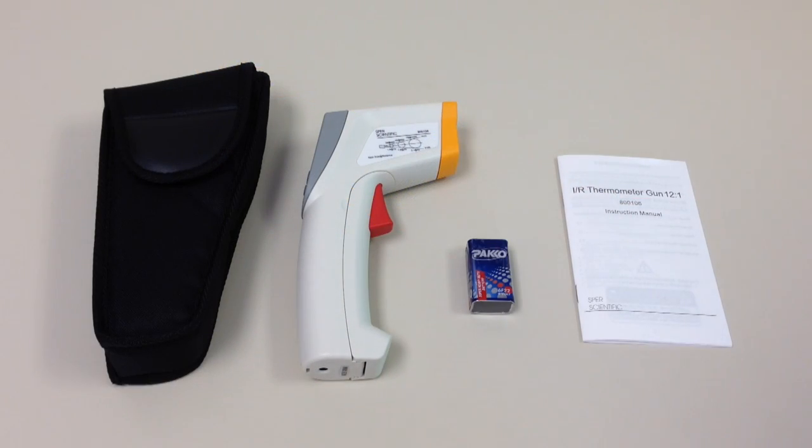Rugged and ergonomically designed Spear Scientific IR Thermometer Gun 800106 comes with a built-in tripod mount, 9-volt battery, and a soft holster with a belt loop.